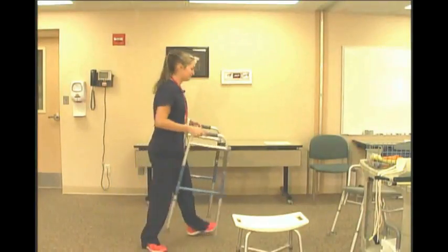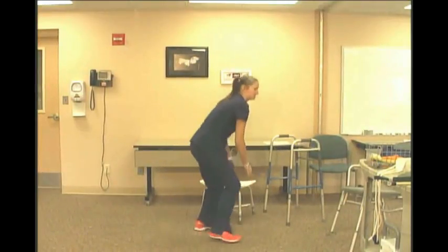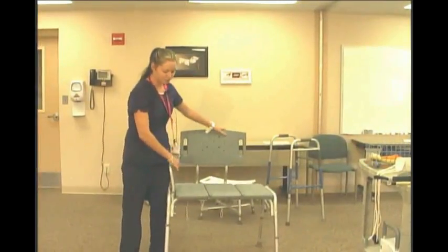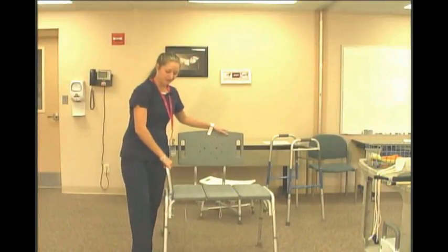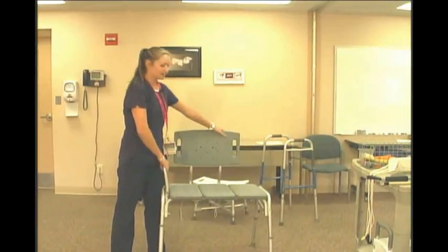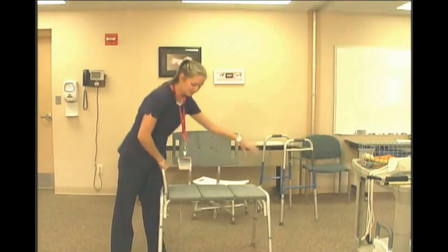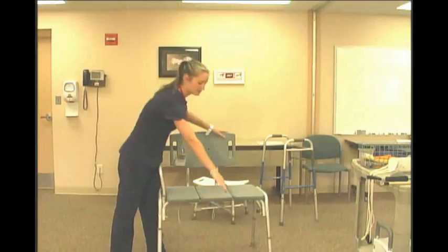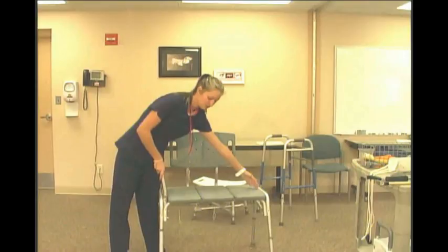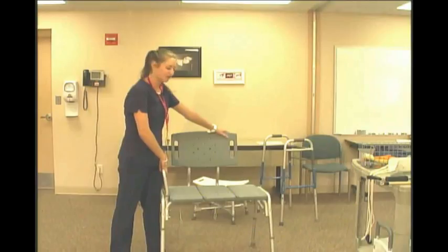The last option for the shower is if you have a tub transfer bench. And that is this guy right here. This is set up for our tub shower here, which inside our shower, it's a little bit elevated, so it looks kind of broken, but it's not. This is the Cadillac of the tub transfer benches. So as you can imagine, these two legs are outside the tub, these two legs are inside, and the edge of the tub runs in between. So all you have to do is sit on the edge right here, and as you're sliding across, you lift one leg in and then the other. Works very well. It's very, very safe.